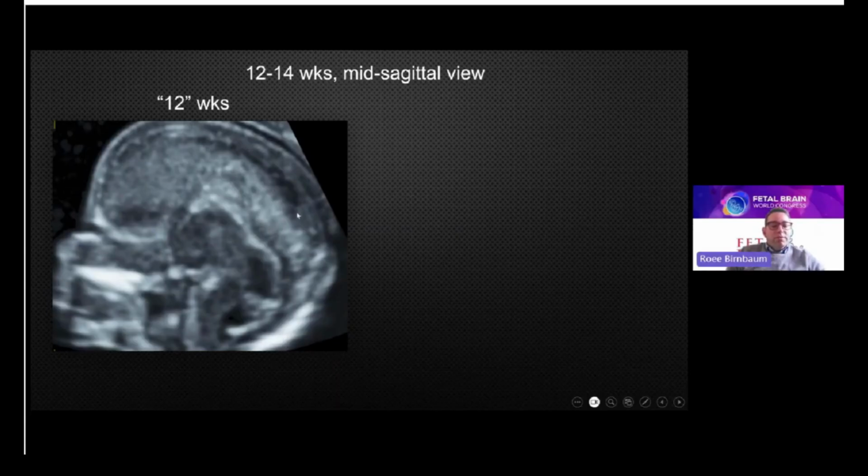At 12 weeks you are performing the nuchal translucency, but this is a high resolution transvaginal ultrasound through the anterior fontanelle. And let's go and try to teach you the pattern recognition of this structure. So the first thing you should recognize is that there's echogenic falx here, and the falx here is drawing the border between the outside area of the brain and the inner brain. So you see the falx here, and your eyes are looking at what happens below the falx.